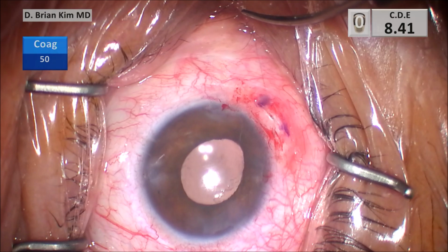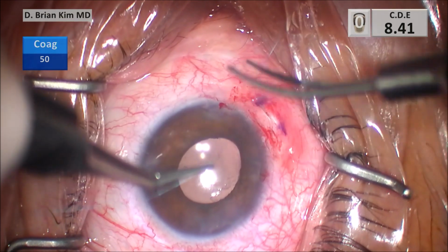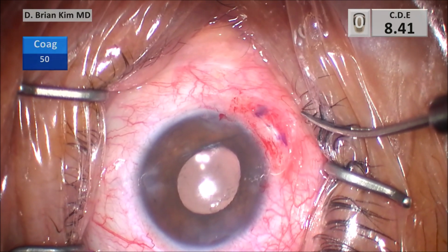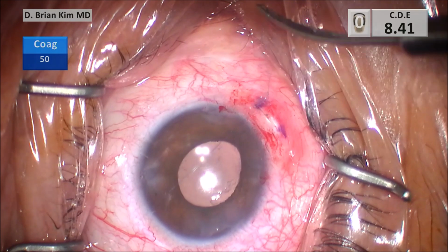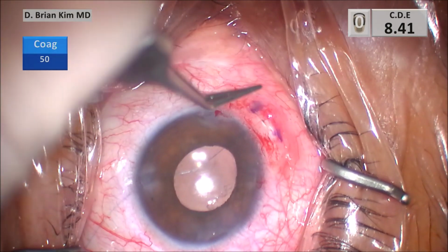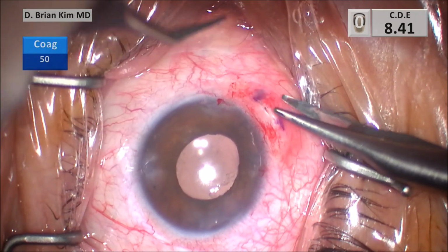You can see it's a little bit dilated more in this area, but you will see that the suture is fairly loose. It's not too tight, but obviously it's tight enough that it's causing a little bit of retraction of the iris. Again, I made sure that I didn't over tighten the suture. It's very important. You don't want to over tighten the suture and potentially cheese wire through the iris tissue.